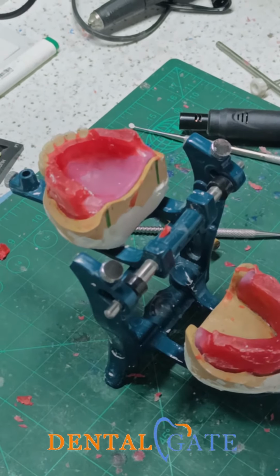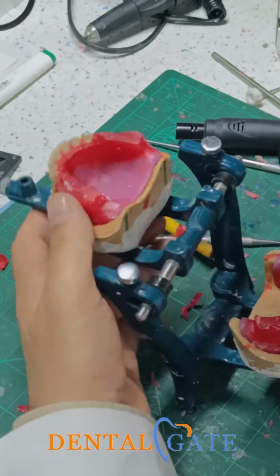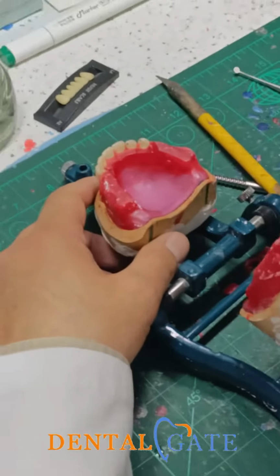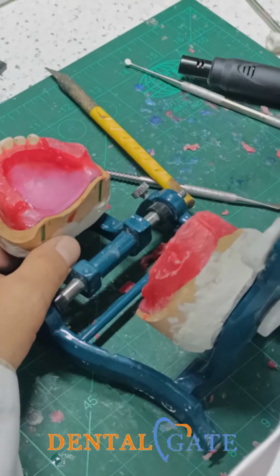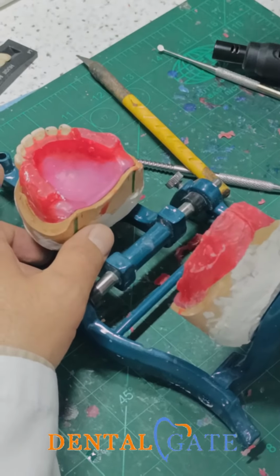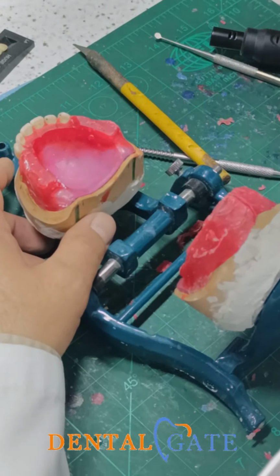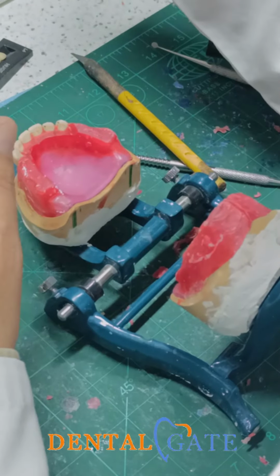So now I will make the arrangement of the lower regarding the upper. What I need now to perform the lower should be more difficult. Why? It's not more difficult, but you should pay attention to the lower, because I will follow the rules of the arrangement for each individual tooth regarding inclination and proper position. And I will match with the midline, and I will make overjet and overbite. You can see, this is your task now.